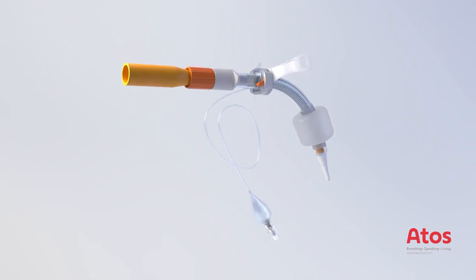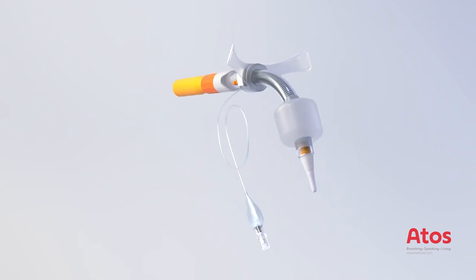The Traco VarioP tubes are pre-mounted on a minimally traumatic insertion system. For the placement of the tube, a silicone sleeve compensates the gap in diameter between the inserter and the tube tip. The sleeve is attached at the guiding catheter.